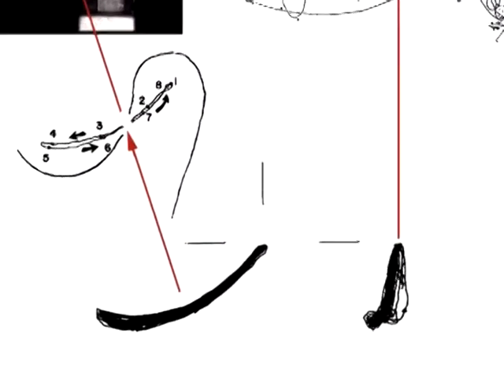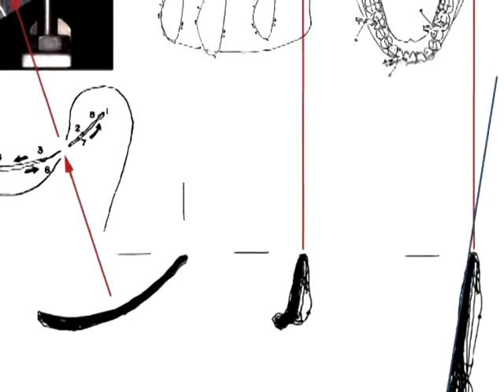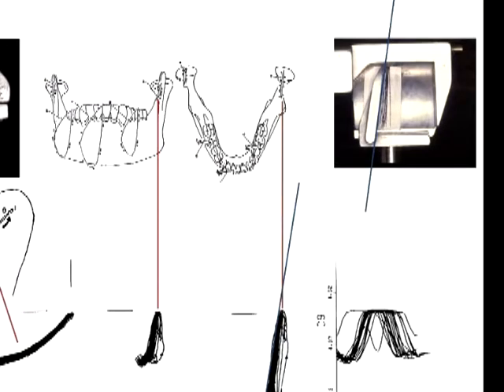The sagittal plane chewing plots are the same ones shown in the head-on frontal view on the right. The narrow movement range in and out of the intercuspal position at the top indicates this subject has almost no lateral translation or Bennett movement. The horizontal plane view of chewing relates to the Bennett angle guide adjustment of the articulator, which will be discussed later.